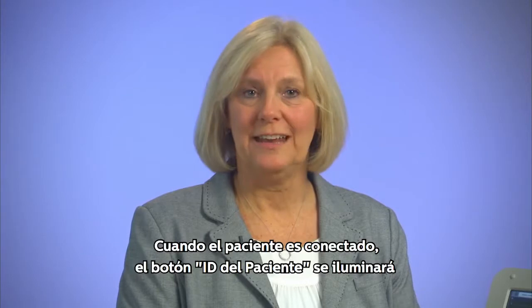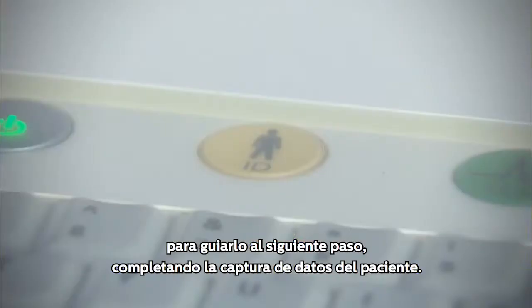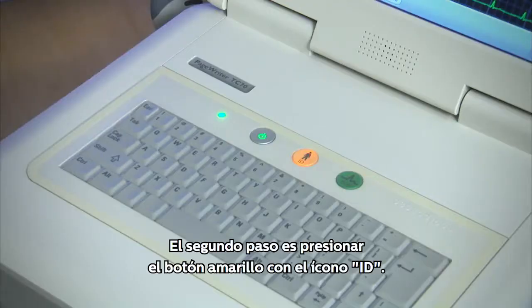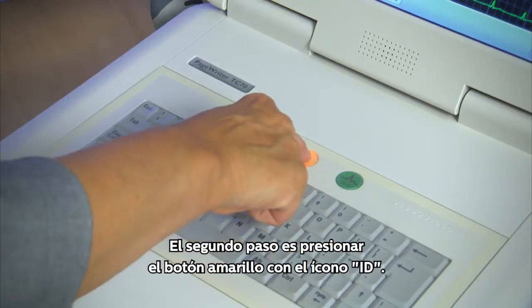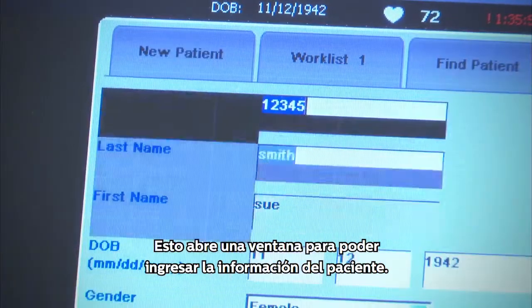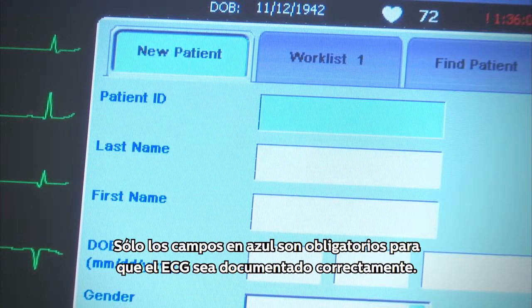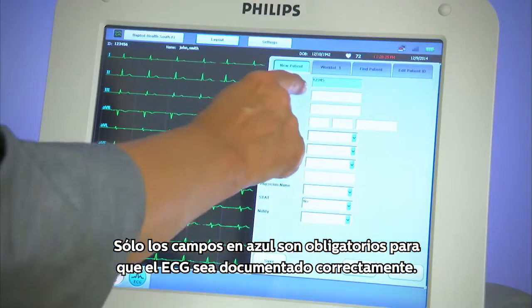When the patient is connected, the patient ID button will light up to guide you to the next step, completing patient data entry. Step 2 is to touch the yellow ID icon. This opens a window to enter the patient information.